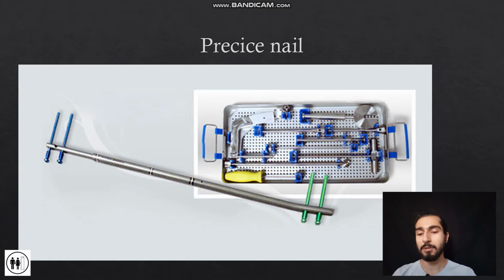in some patients there might be a need to reverse the lengthening process, like when there is too much tension and there is a nerve pain. Shortening the bone a little bit helps to reduce this nerve tension and pain. And in patients who have poor consolidation of bone, when there is slow union of bone, again, shortening the bone by a few millimeters usually helps bone consolidation, and it increases the speed of regeneration.